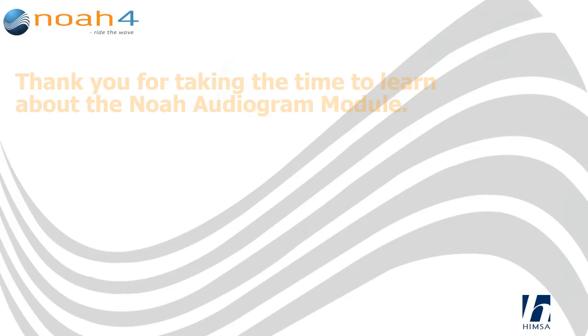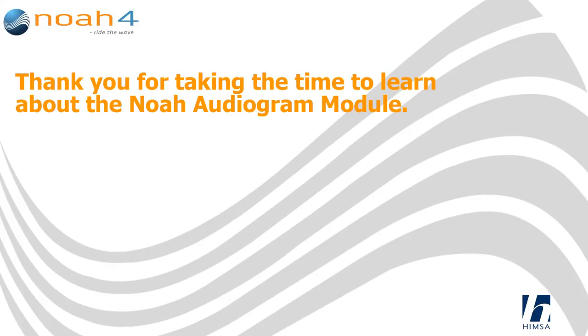Thank you for taking the time to learn about the Noah audiogram module. For more training, please visit the Noah 4 Knowledge Base at www.himsa.com.